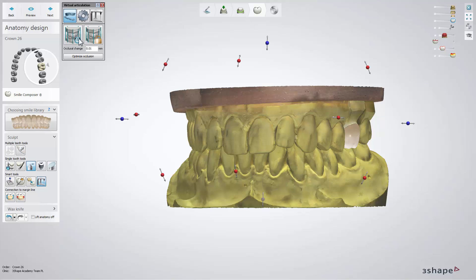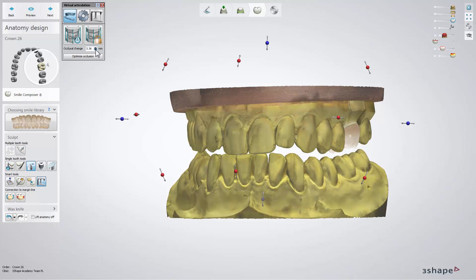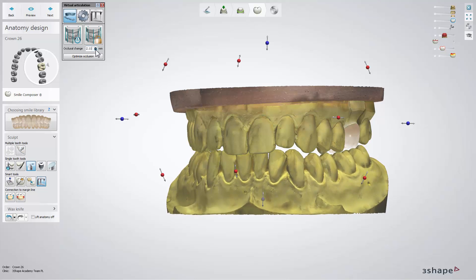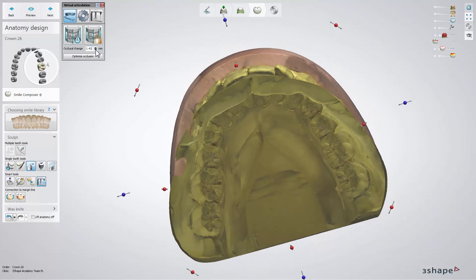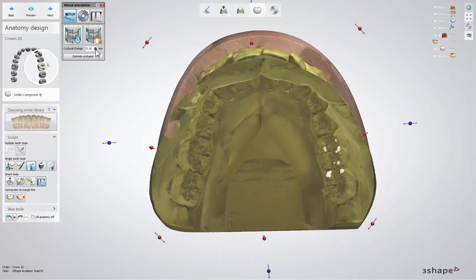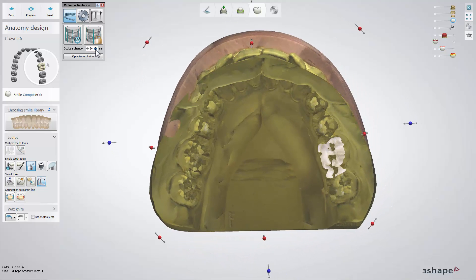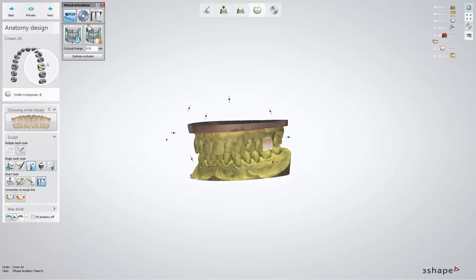To change the occlusion height — that is, the distance between the upper and lower jaw — set the values in the Occlusal Change field and click on the Lock Current Alignment button.